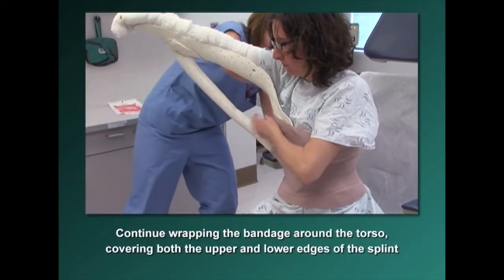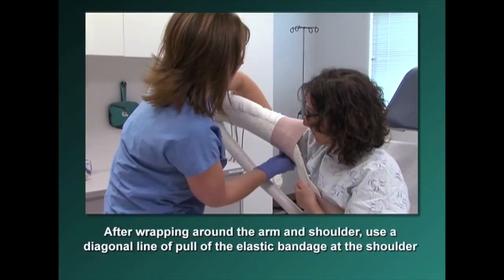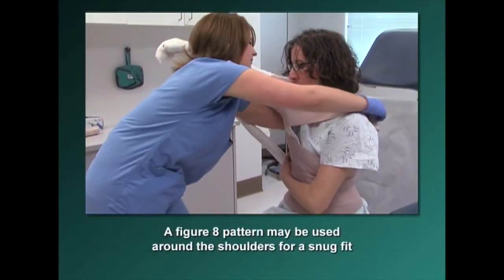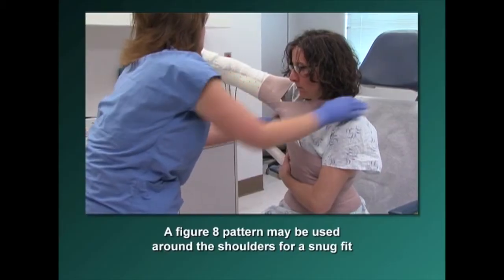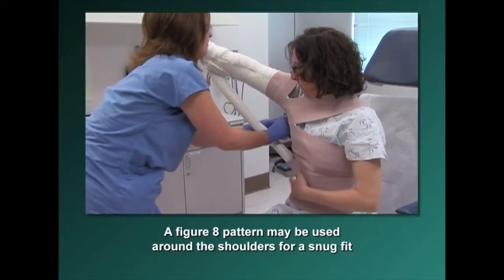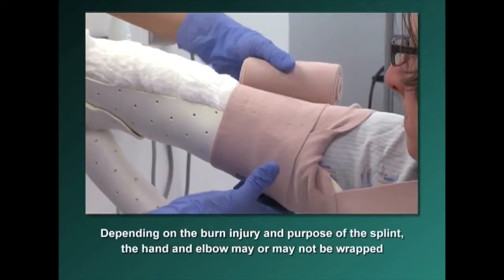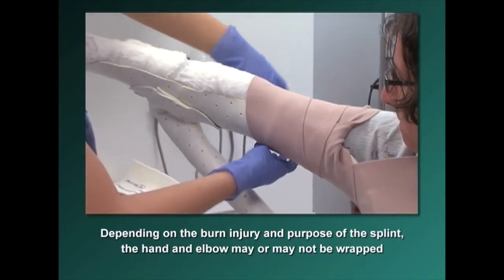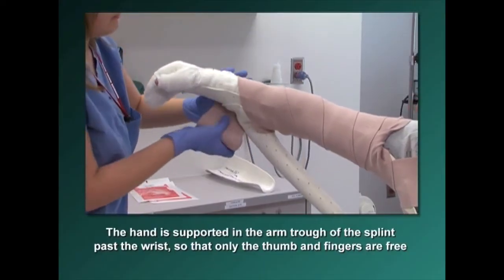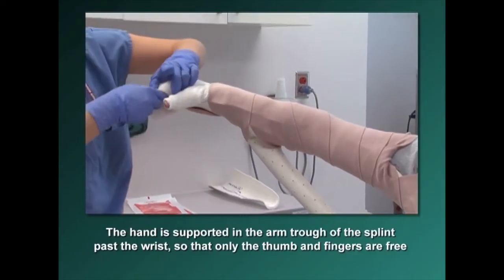The arm will fit gently into the trough of the splint. After wrapping around the arm and shoulder, use a diagonal line of pull on the elastic bandage at the shoulder to secure the splint. A figure-8 pattern may be used around the shoulders for a snug fit. Depending on the burn injury and purpose of the splint, the hand and elbow may or may not be wrapped into place. The patient's hand is supported in the arm trough portion of the splint past the wrist so that only the thumb and fingers are free.